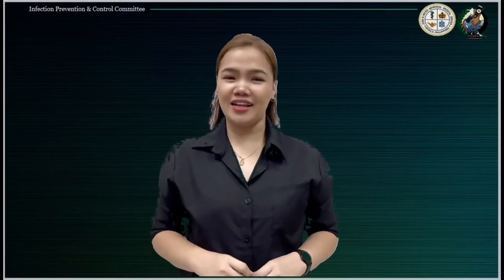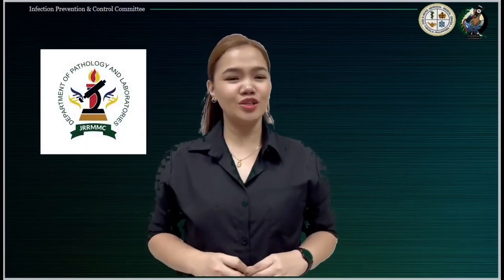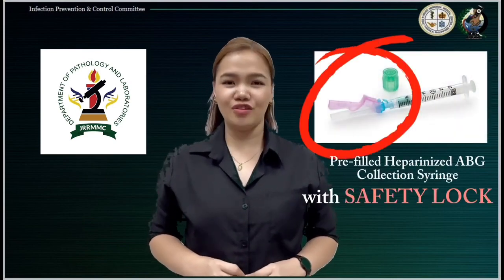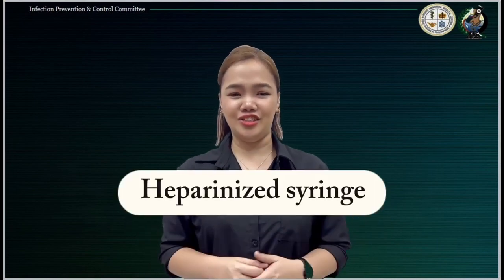One of the notable innovations of the Pathology and Laboratory Department is the utilization of pre-filled heparinized ABG collection syringe with safety lock features. This syringe is used to extract ABG blood samples using a pre-filled syringe, or what we commonly know as a heparinized syringe.